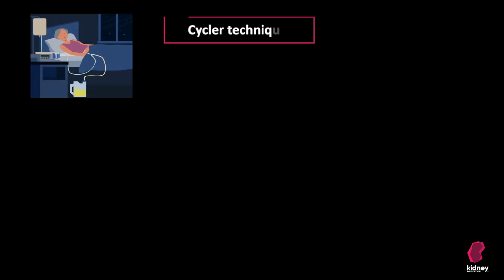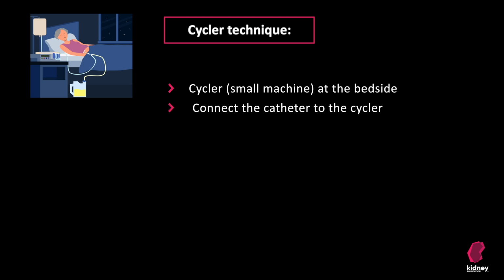The other way to do peritoneal dialysis is with a cycler. A cycler is a small machine. It is usually kept at your bedside. Connected to this cycler, there are bags with new dialysis fluid and empty bags. You connect the catheter to the cycler at night when going to bed.